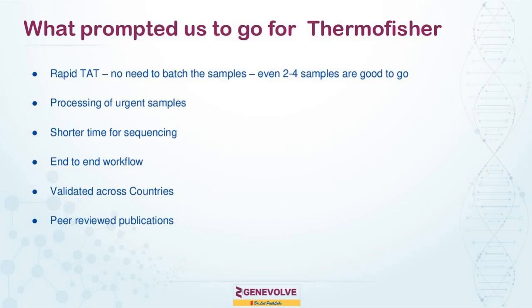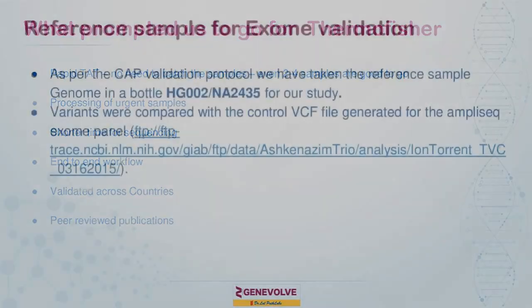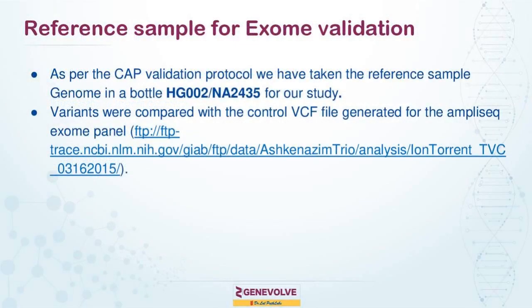This system has been validated across countries, and there are many users, and there are peer-reviewed publications for this system which are available. As part of our validation studies, because we wanted to fully validate the system before we actually employed this for clinical testing, we took a sample from what we call the Genome in a Bottle. This sample has been extensively characterized and sequenced throughout the world, and we wanted to check our concordance with what is available in the literature.